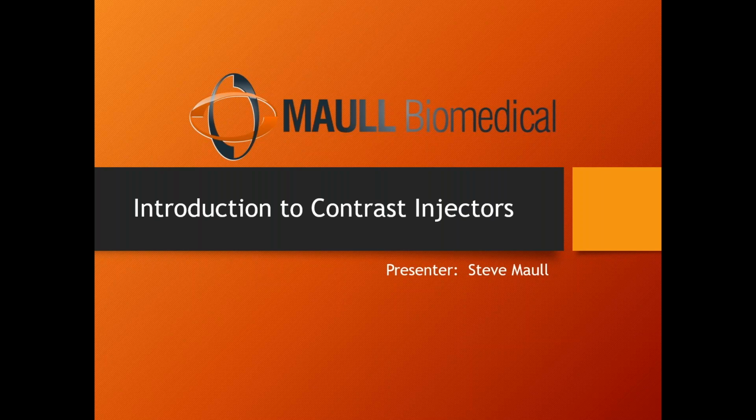But before we get into this, who here doesn't know anything about imaging or how an image is produced? It's fine, you don't have to know, but anybody? All right, so we're all aware, so I can dumb this down a little bit more. Your typical image, think of a normal X-ray. Chest X-ray, got a patient on the table, and normally there's an X-ray tube above the table, and some image capturing device. It used to be film, now the digital plate is inside or underneath the table. Fire the X-rays into the patient, it produces an image.